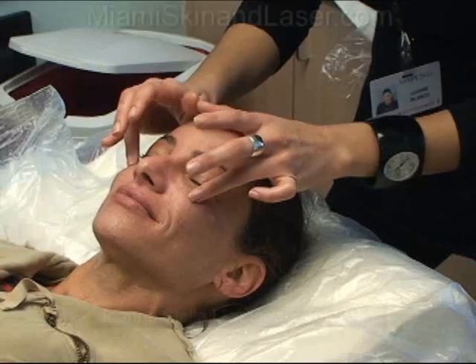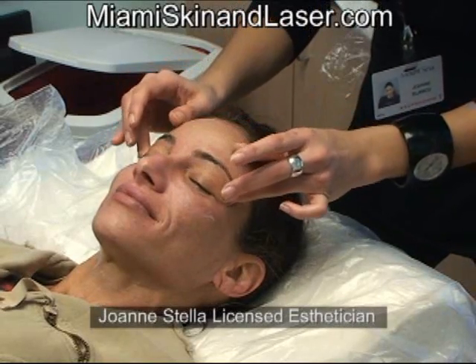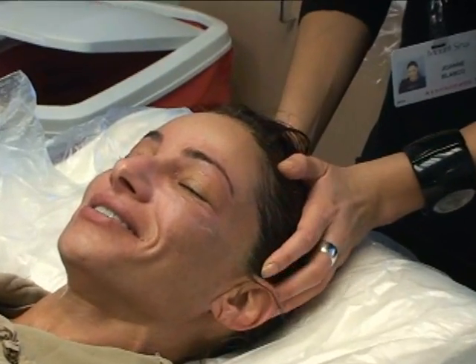So we've essentially completed the treatment for today. And then Joanna, my esthetician, is going to come in and do a little cooling mask treatment so that the patient's more comfortable. Thank you. Thank you, Dr. Zaiac.